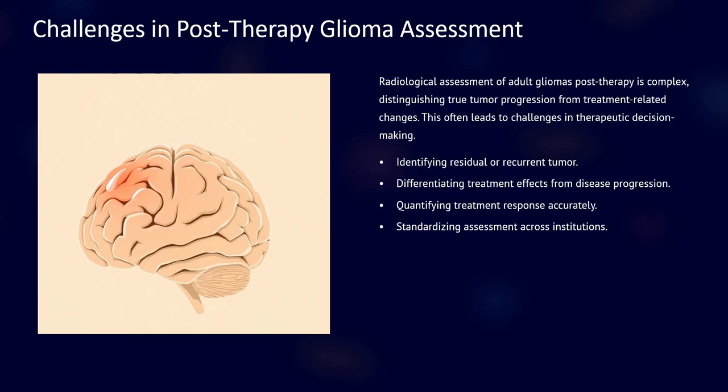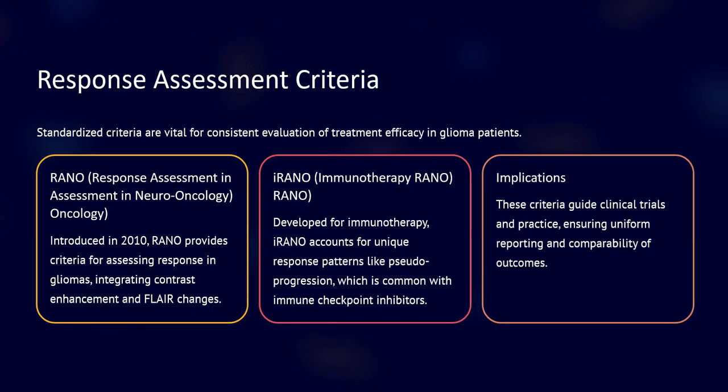There is a challenge in post-therapeutic glioma assessment. We have to identify residual or recurrent tumor, differentiate progression from pseudo-progression, quantify tumor response accurately, and standardize the assessment.